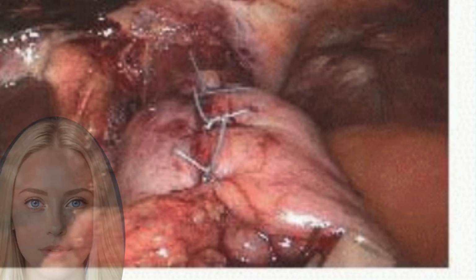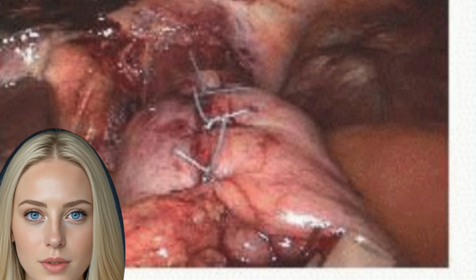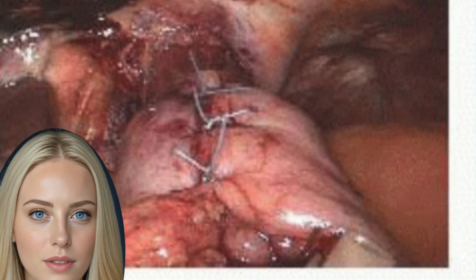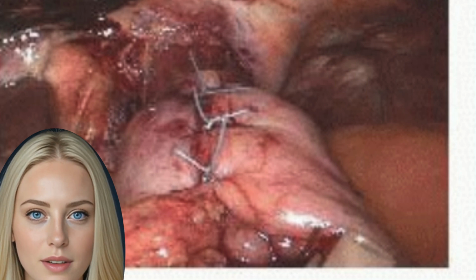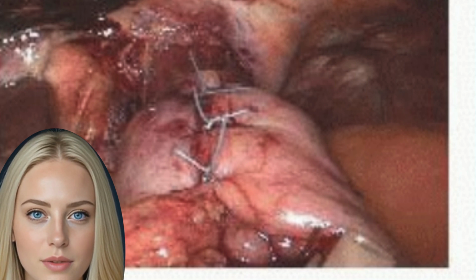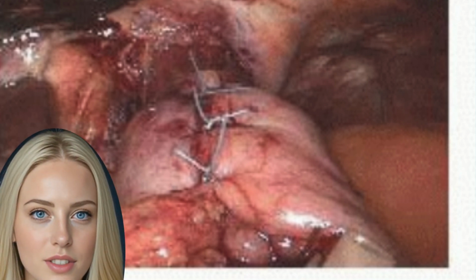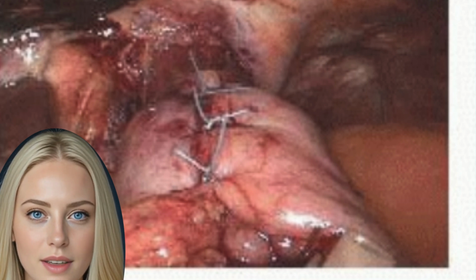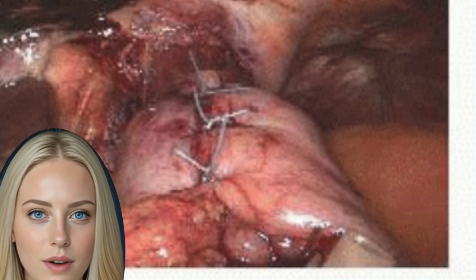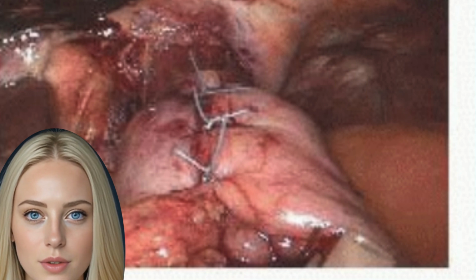edges, Fig 16A-B. Pledgets are used on the sutures with the exception of the last sutures, to avoid pledget ingress into the esophagus. The quantity of sutures usually numbers 2 to 4, until there is a gap left between the esophagus and crura to easily interpose laparoscopic graspers between the closure. If the esophageal hiatus is gigantic, then anterior closure, in addition to posterior, can be safely performed to prevent severe angulation of the esophagus at the newly reconstructed hiatus.